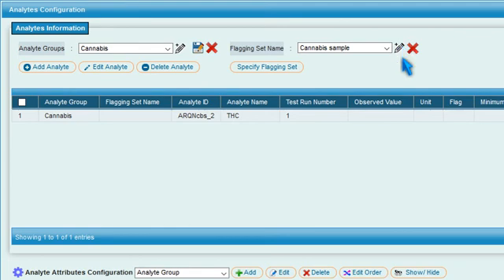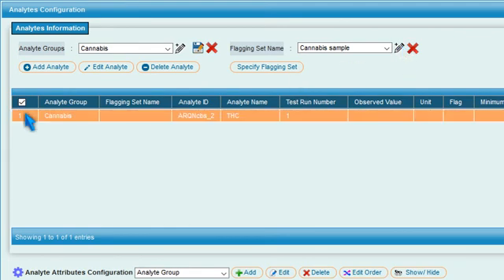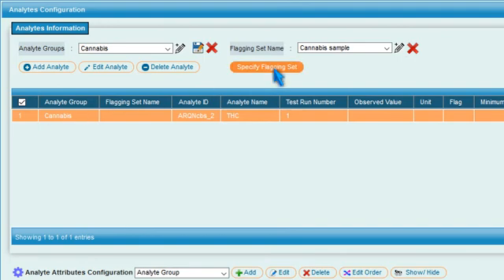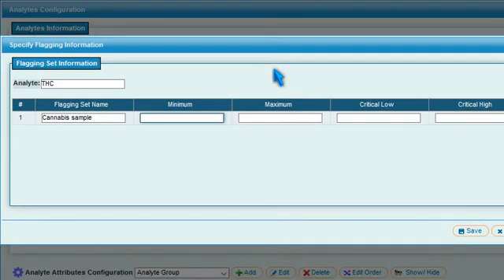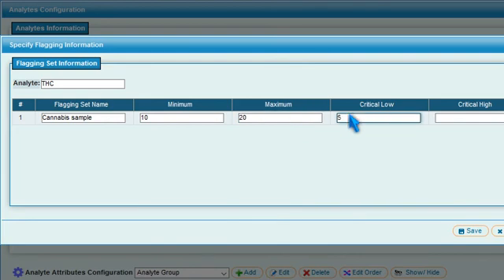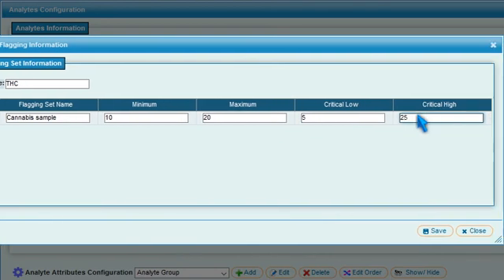To specify information for the selected flagging set, select an analyte and then press Specify flagging set. Specify Minimum, Maximum, Critical Low and Critical High values and press Save.